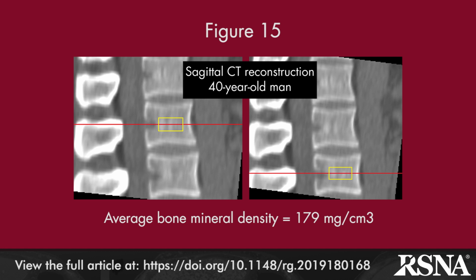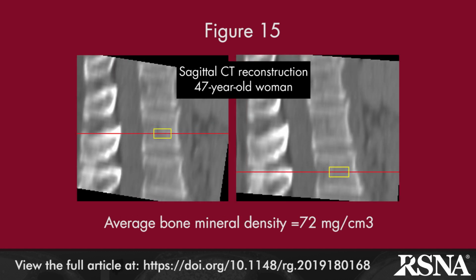Quantitative analysis of bone mineral density at L1 and L2 that are included on most chest CT examinations can be used for the diagnosis of osteopenia and osteoporosis.